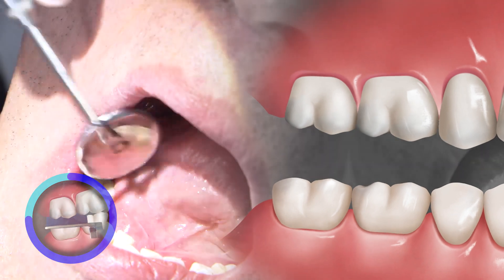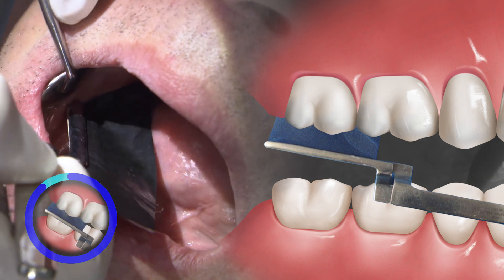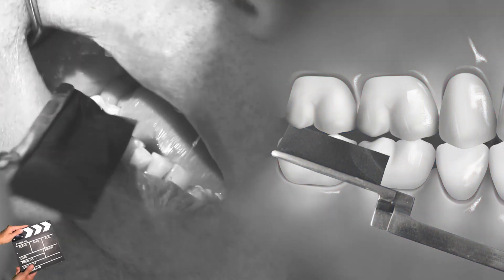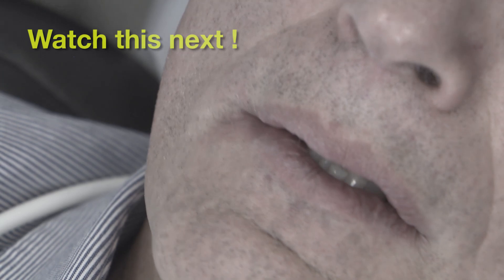Now that the restoration is secured into place, we do want to check all these aspects again. Go ahead and bite down together, tap tap, and bite hard together. How does it feel right now? Very good. Feels very good.